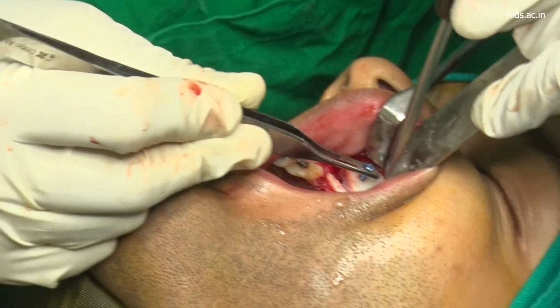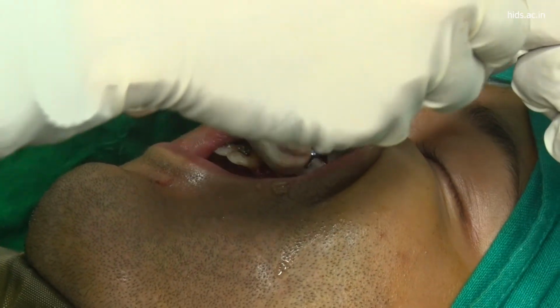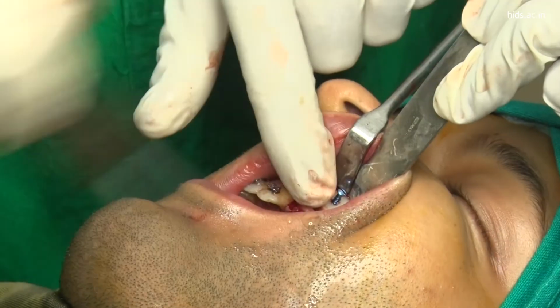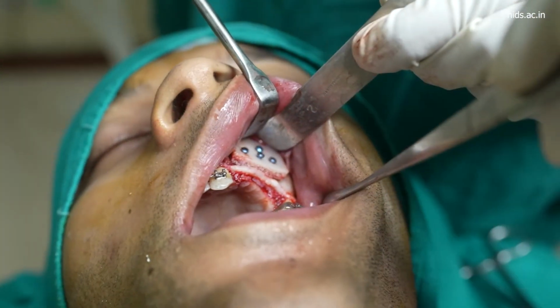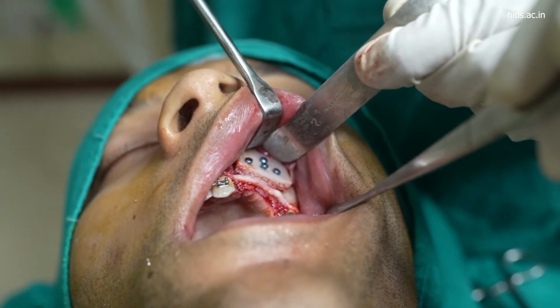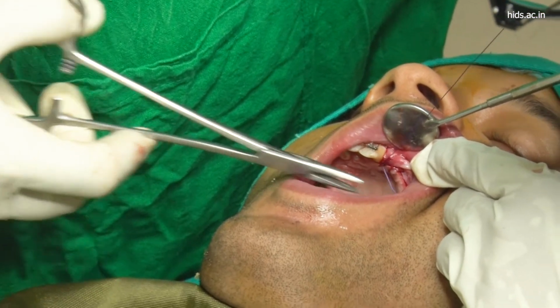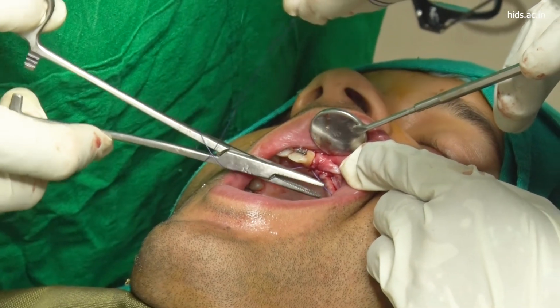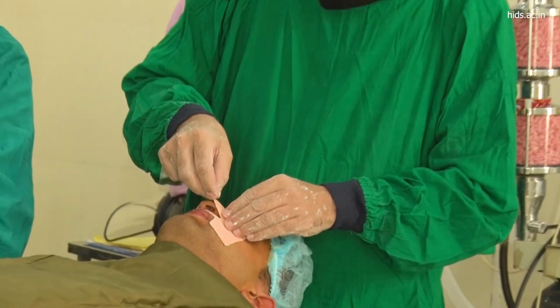Fixation of the graft is done using 4 titanium screws so that the graft is nicely fixed and it should not become loose after the fixation. Closure is done in a very passive manner using interrupted Vicryl sutures. Pressure bandage is given to reduce post-operative swelling.